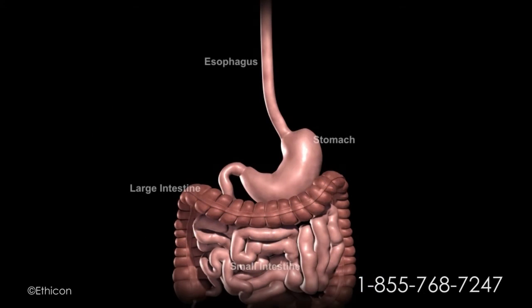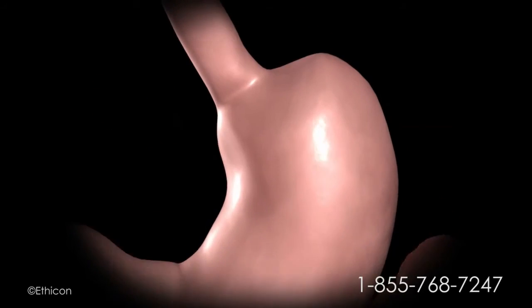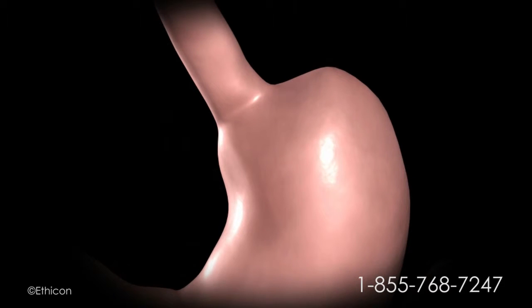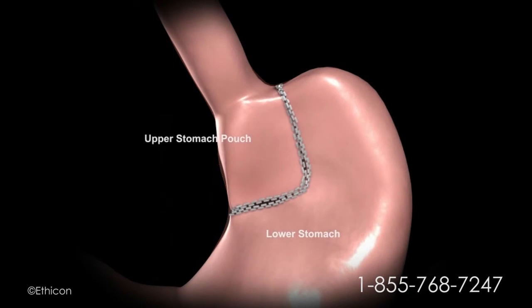The surgeon examines the abdominal cavity using a laparoscope or video camera. A small stomach pouch is created using a stapling device.